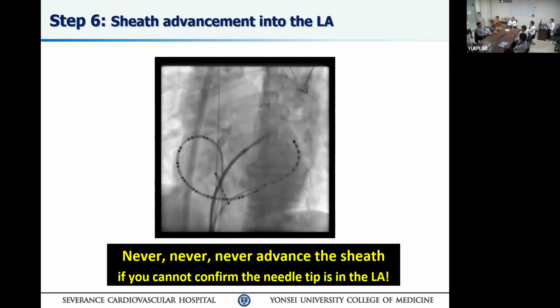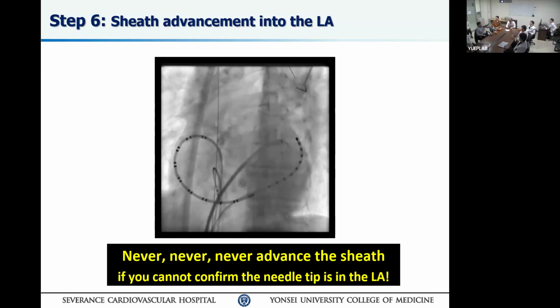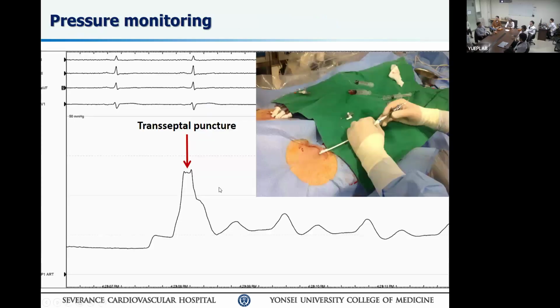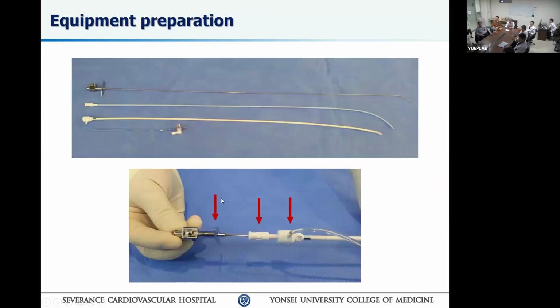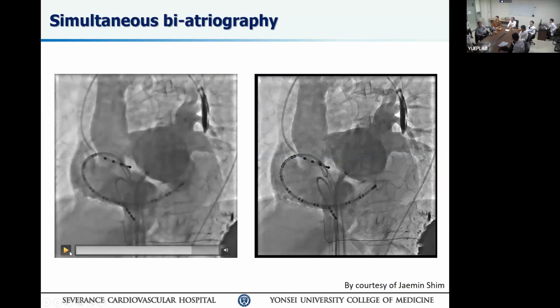Very difficult to penetrate. At the beginning of your slide, you showed the LA and the RA, that patient looks like they have a lipoma. Yeah, partially lipomatosis. So those are patients where you really need to pay attention to the anatomy, right there.